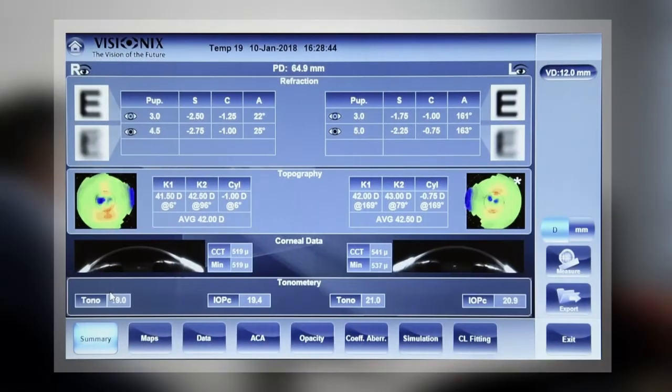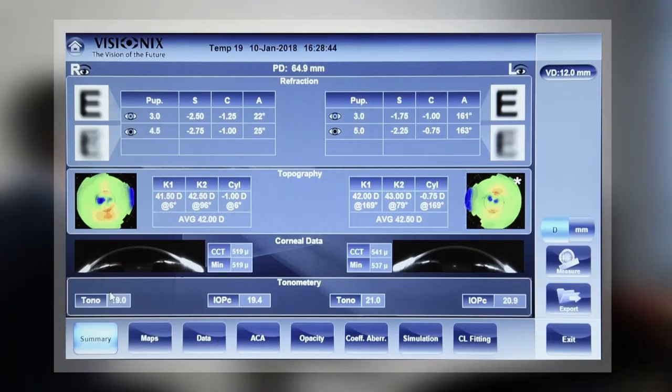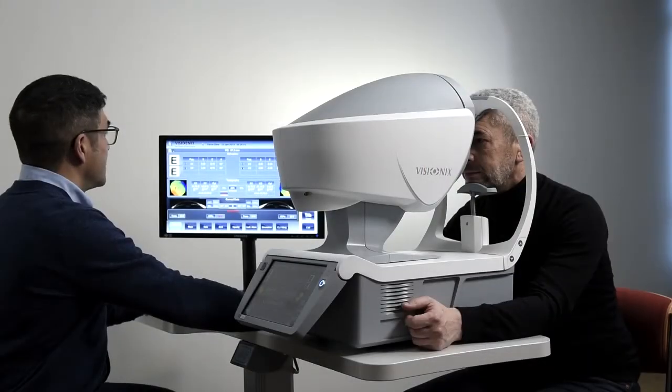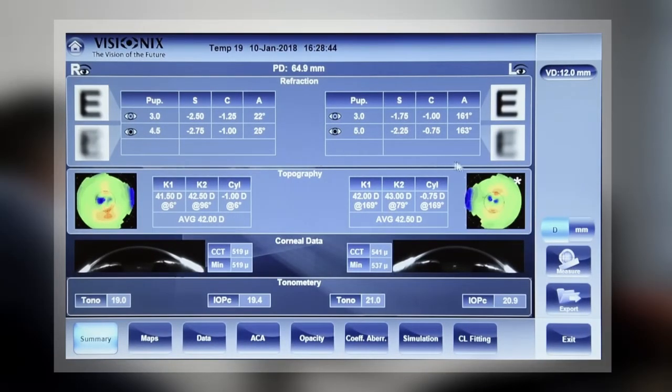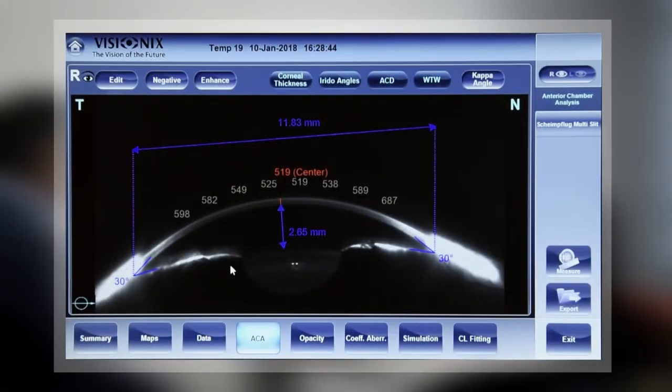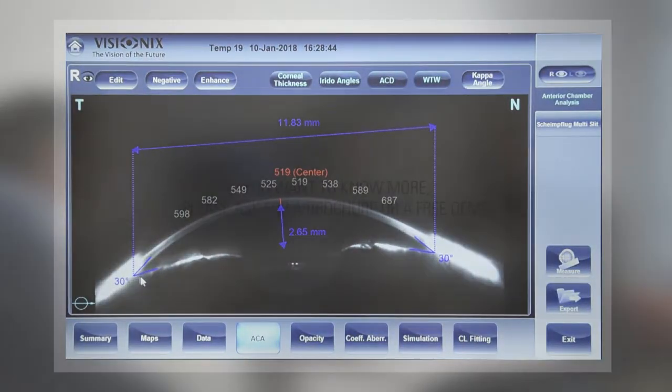Next, you will directly access a screen summarizing the main information gathered during the examination. This first report provides a summary of your patient's overall visual health. You can also view the image of the anterior chamber as well as additional data.